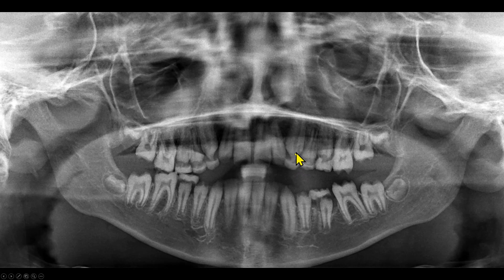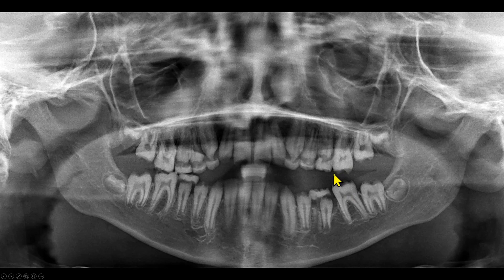Look at the crowns of the unerupted maxillary canines — these are very pointed. Again, I do not see any enamel layer. Look at the cusps of the molars; these cusps are also very pointed.